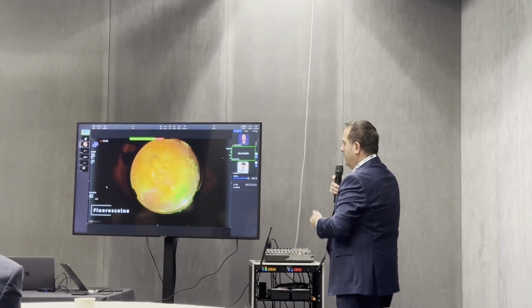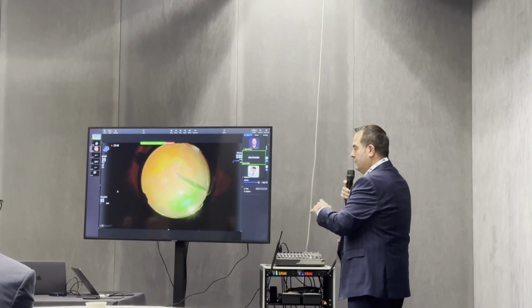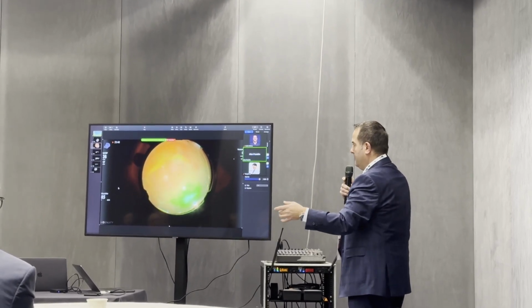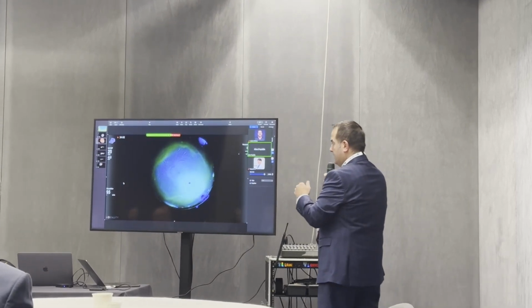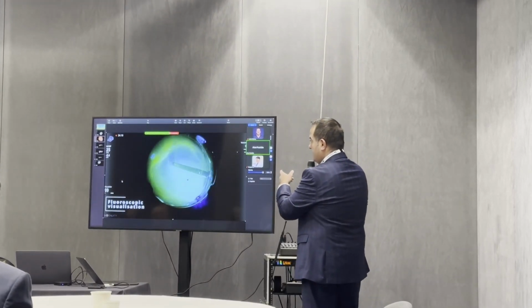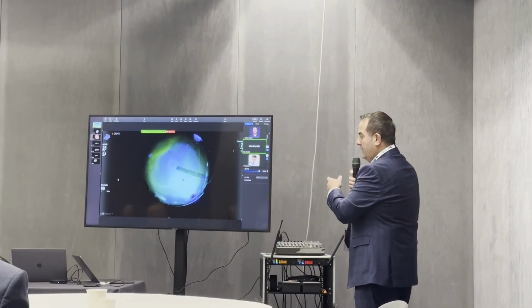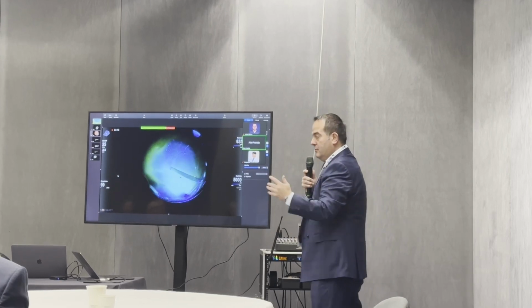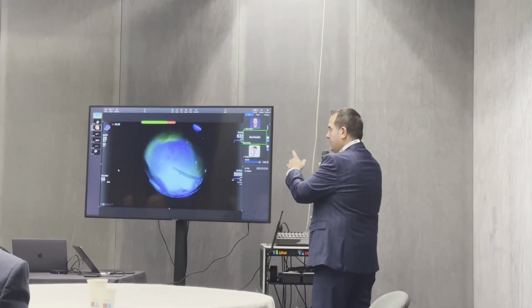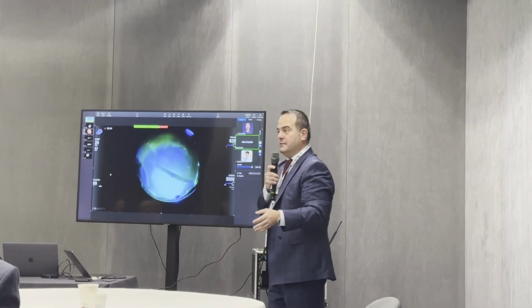And now, over a PFCL bubble, another good thing, the fluorescein doesn't mix with PFCL, so we can use it at the same time. And you can see how much vitreous, especially in the periphery, is left in this eye. So it's debatable, should we clean thoroughly the vitreous or not, but at least here is shown that we don't see the vitreous with the current staining agents.